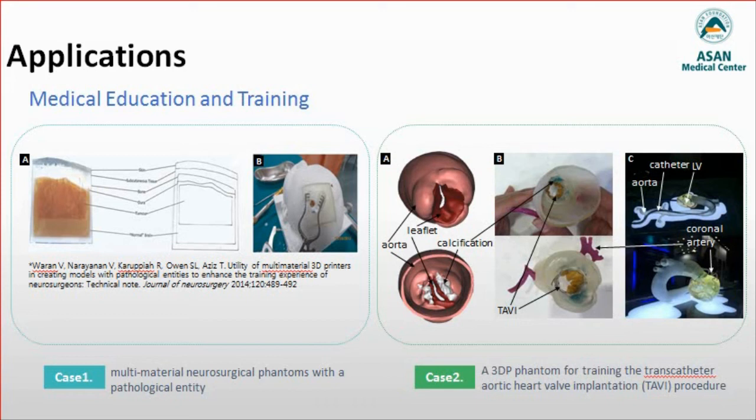From the CT data, they used in-house software to generate a 3D reconstructed model of the skin, bone, dura, and tumor, and manufactured 3D phantoms by using a 3D printer. They stated that their trainees practiced the basic steps from navigation and planning of skin flaps to the initial steps in a craniotomy and simple tumor excision.